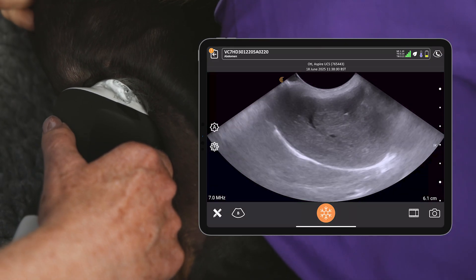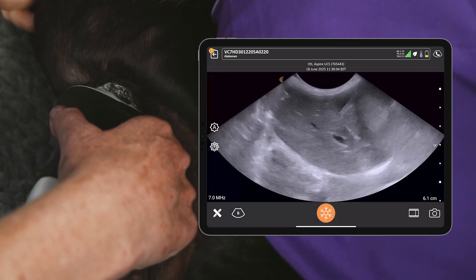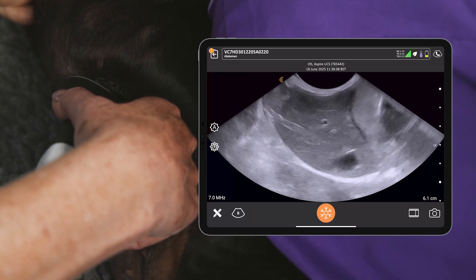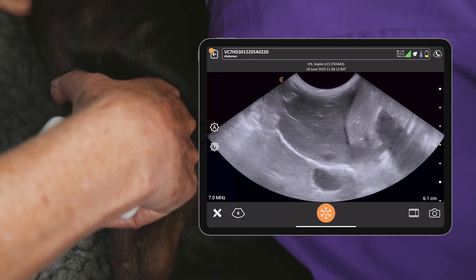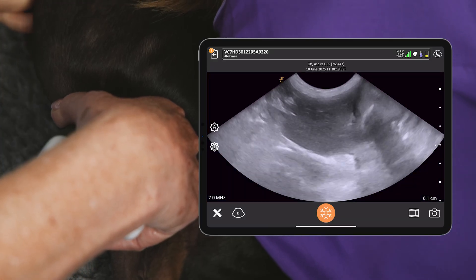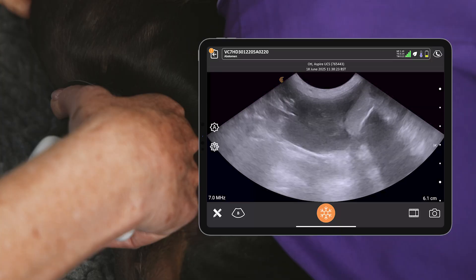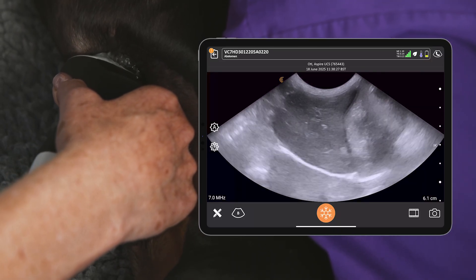We're going to scan down towards the table slowly, paying attention to the structures as we go down. You can see my hand tilting down towards the tabletop — we get a cheeky peek at that gallbladder and there's our mirror artifact of the gallbladder the other side of the diaphragm. Carry on scanning until we run out of liver. It's really important that you keep scanning all the way through to the outer boundaries, otherwise you will miss something.